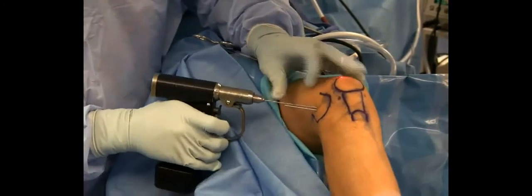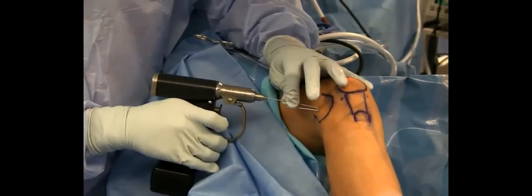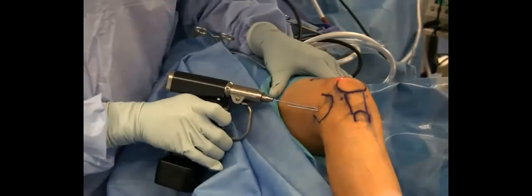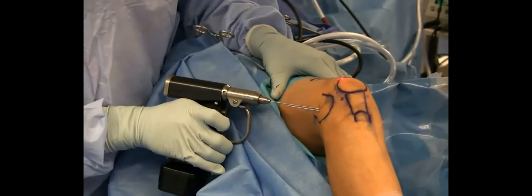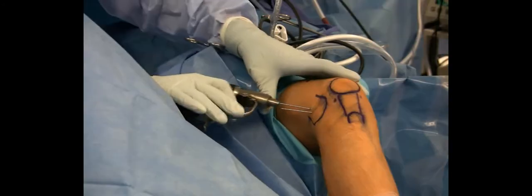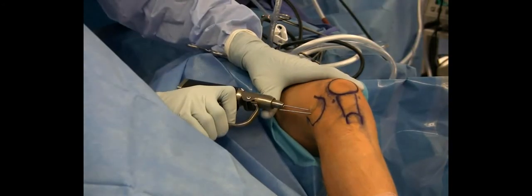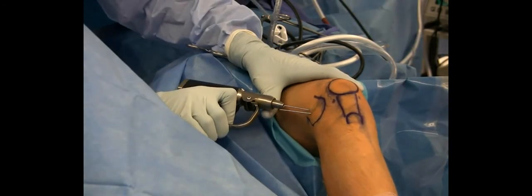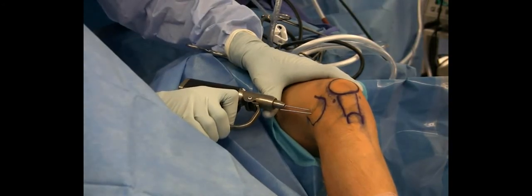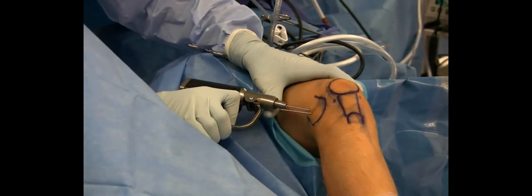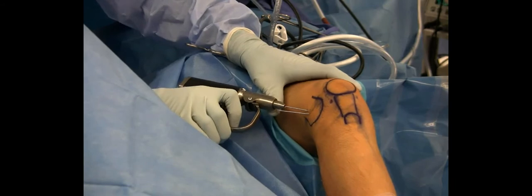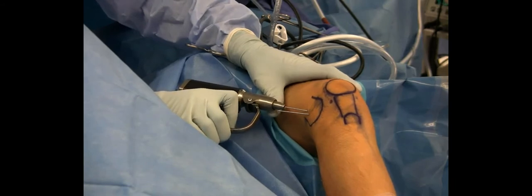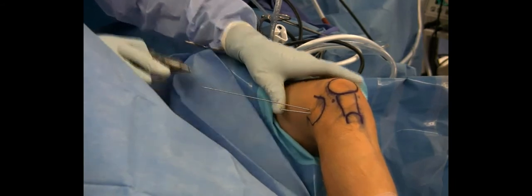This is the alternative or second technique that can be used, which is just a freehand technique. Once again, you use the guide wire to show you where you need to drill. Then multiple perforations are made to the level of the subchondral bone.